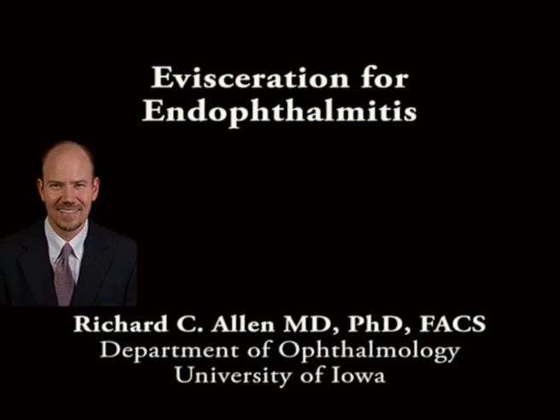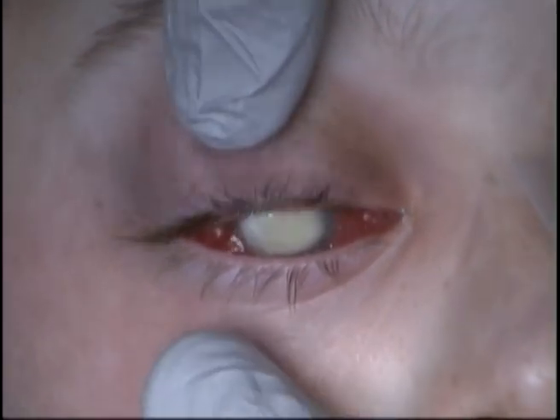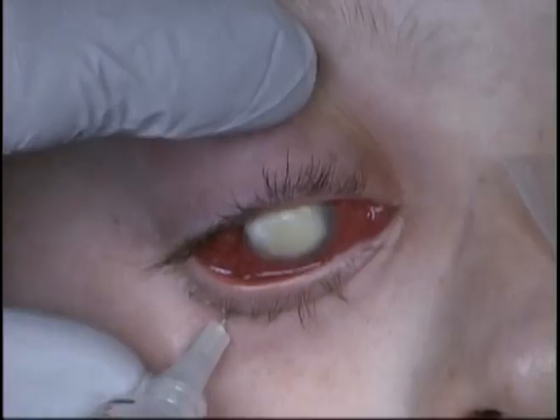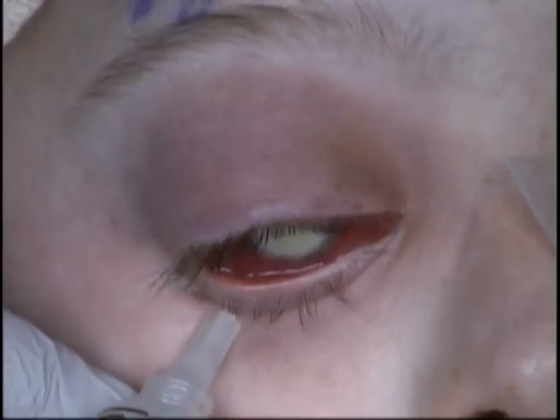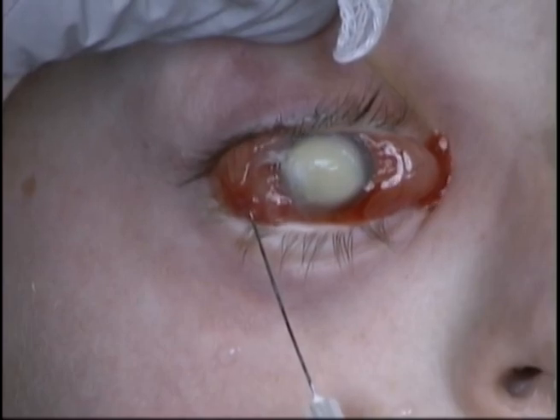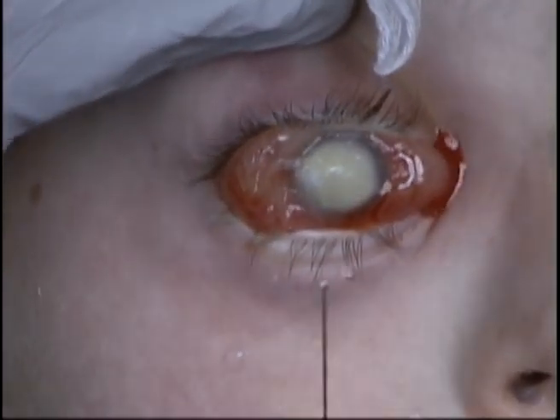This is Richard Allen at the University of Iowa. This video demonstrates an evisceration in a patient with endophthalmitis. Due to significant inflammation in this case and tendency for bleeding due to the inflammation, a retrobulbar block and subconjunctival injection are placed with lidocaine and bupivacaine with epinephrine.